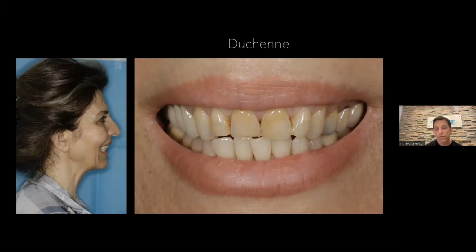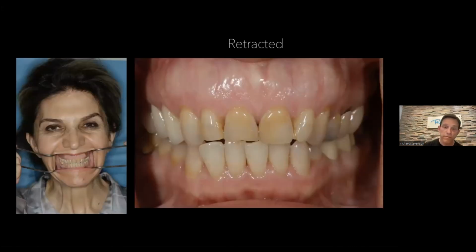So the teeth would need to have more preparation done. Does that make sense? So we say the word jump the lowers, jump the teeth. If the upper teeth are back like this and you want to get them in front, you're going to have to prepare this tooth more to get that smooth transition from the lingual to the facial.